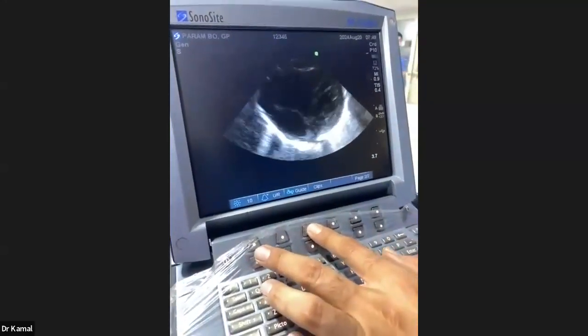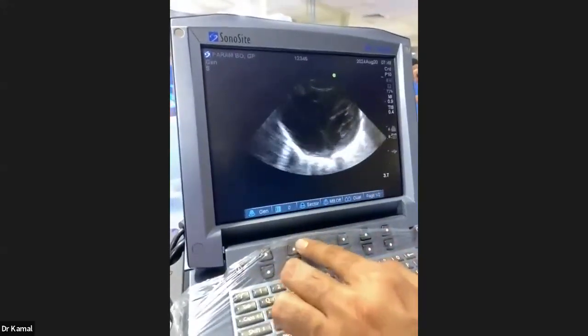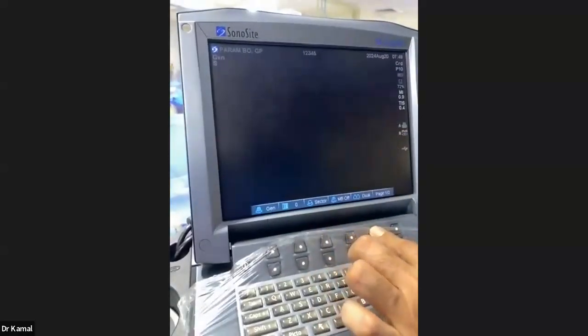So this is the guide, which we don't use because this is for the biopsies. Clips I don't want. Then I'm interested in sectors, something which can decrease or increase the sectors. Fine, which is again some dual. If I want one or two images, I can get those two images.